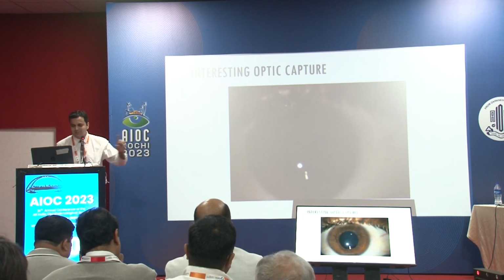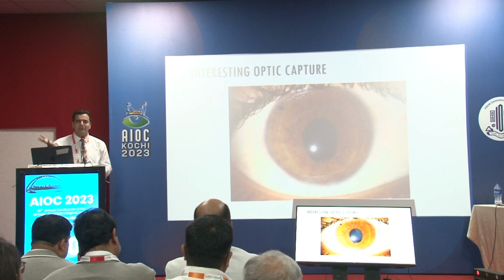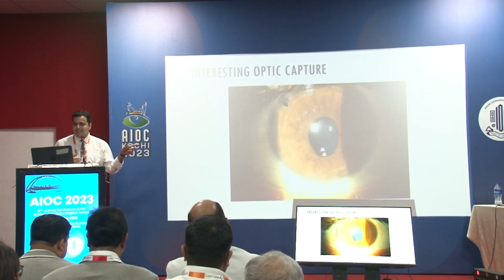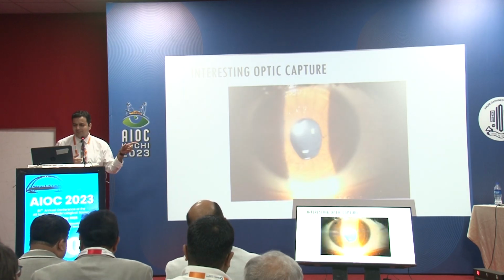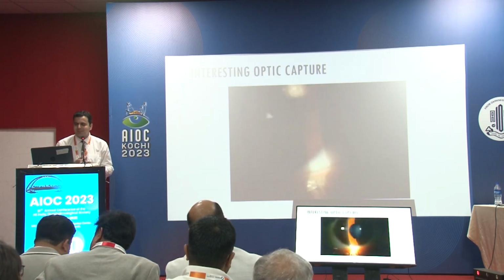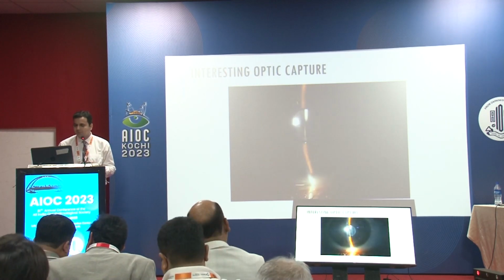It's an 80-second video of a hyperopic phakic IOL. It would perhaps be seen here. It had an optic capture, and we were planning to take the patient to the OT just for repositioning the lens. But I told my fellow to just go up and take a picture of it. She started constricting the pupil with the high beam light, and we were absolutely fortunate that the optic capture was completely reversed just by using this particular light. So you will see that here it goes, and the patient still comes for follow up. We didn't have to do anything for this particular optic capture.